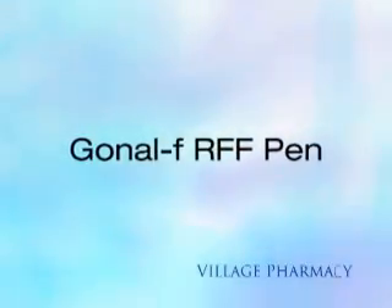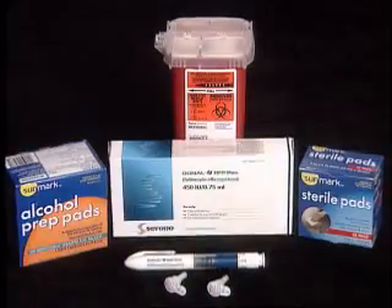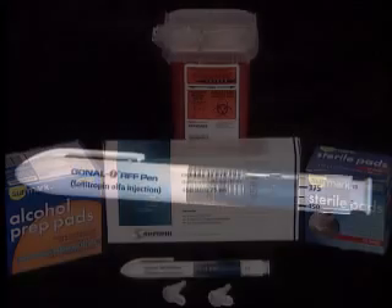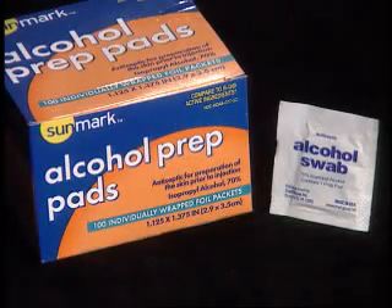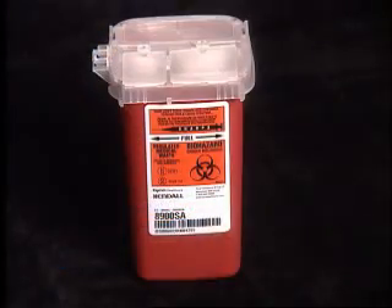You are viewing Village Pharmacy Med Series for Gonal F RFF Pen. The pens come supplied in 300, 450, or 900 international units. The supplies needed are Gonal F Pen, Pen Needles, Alcohol Wipes, Sterile Gauze Pads, and a Sharps Container.